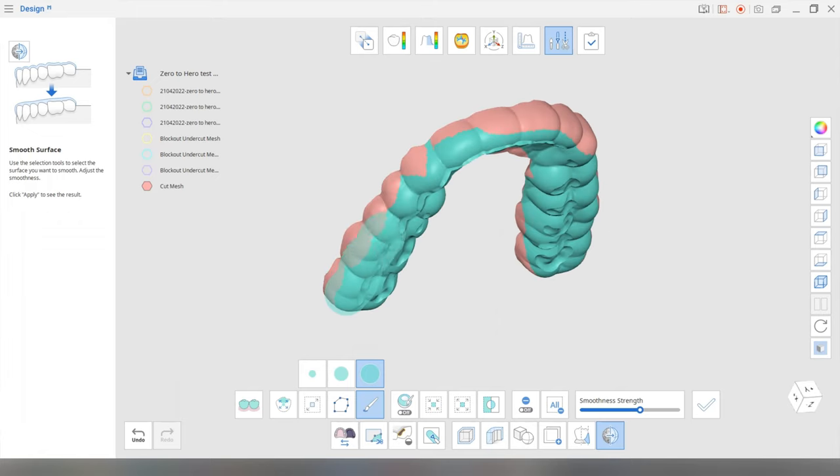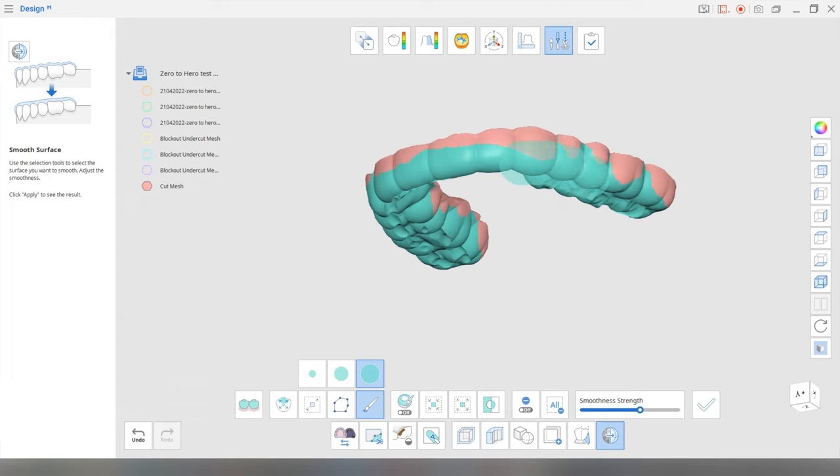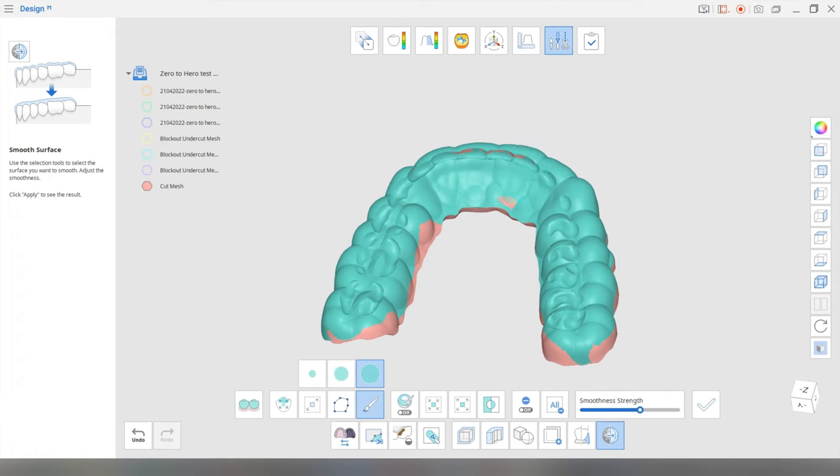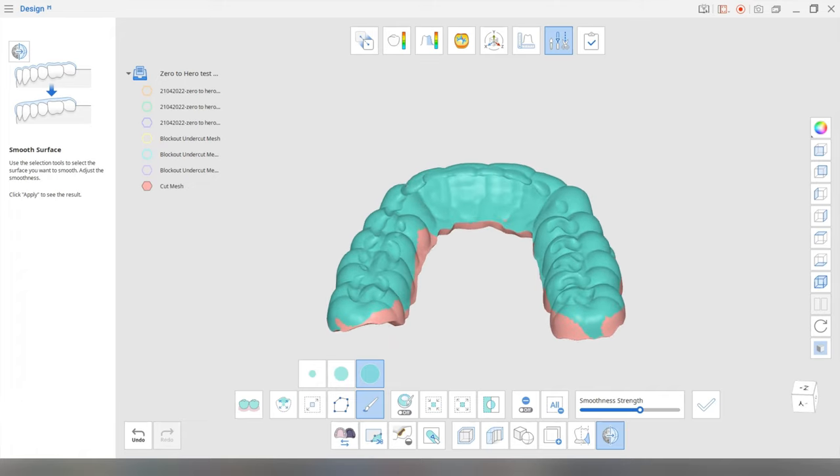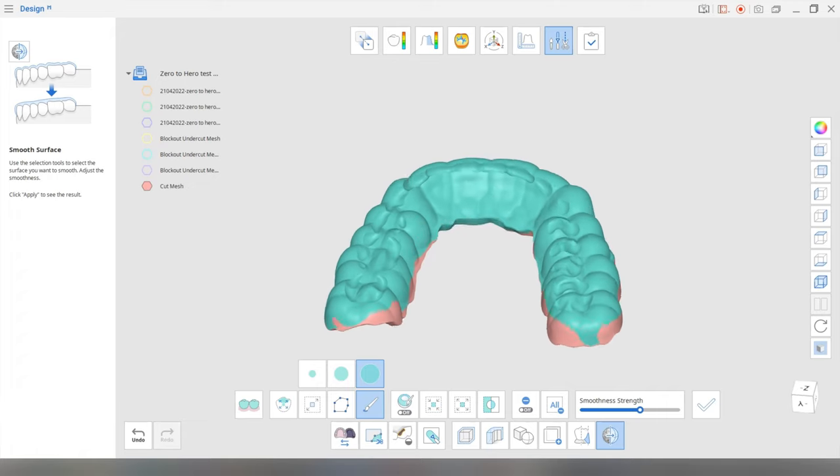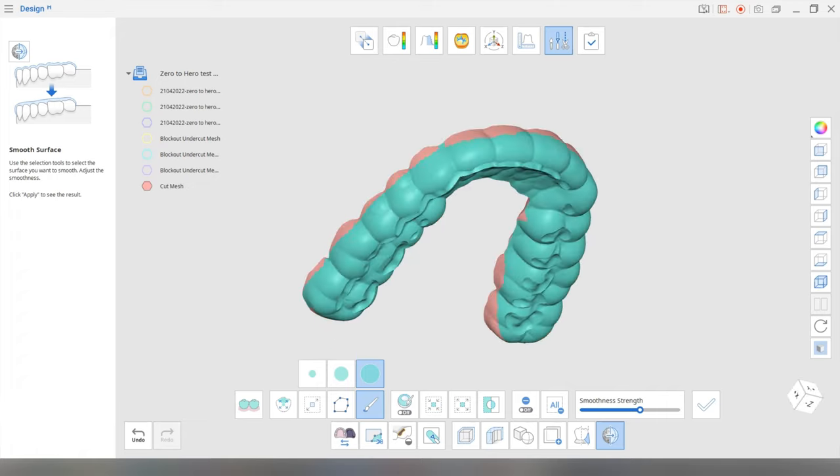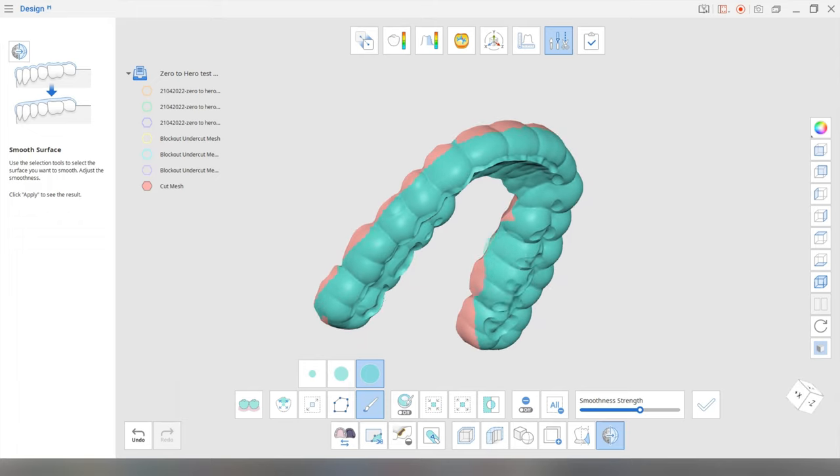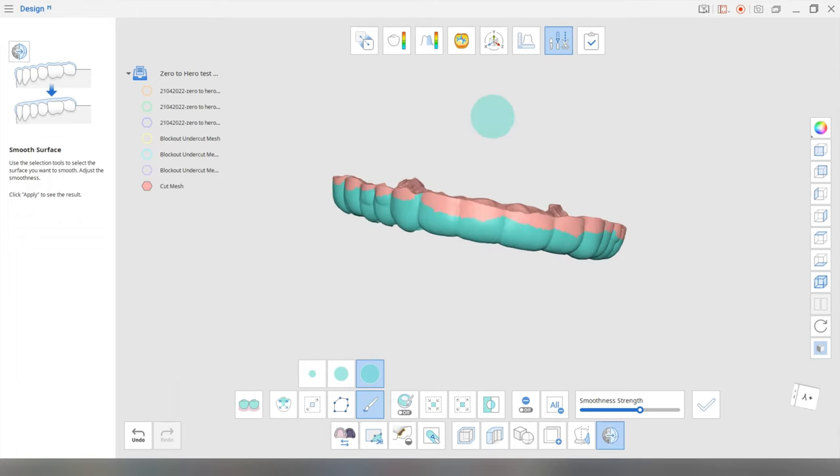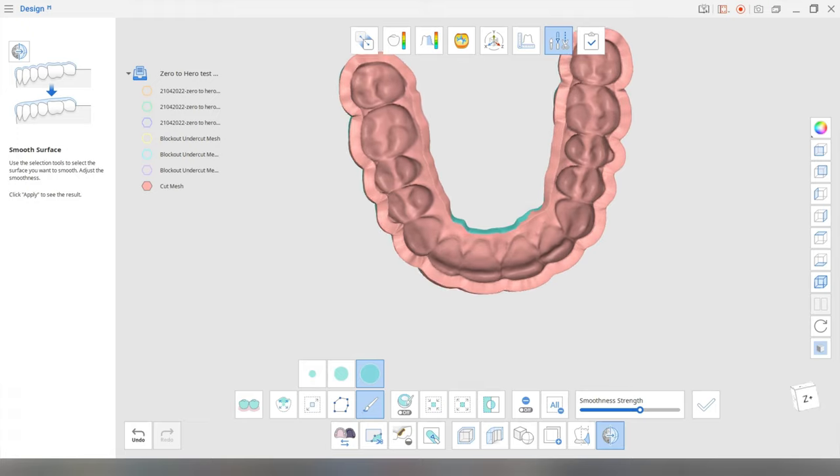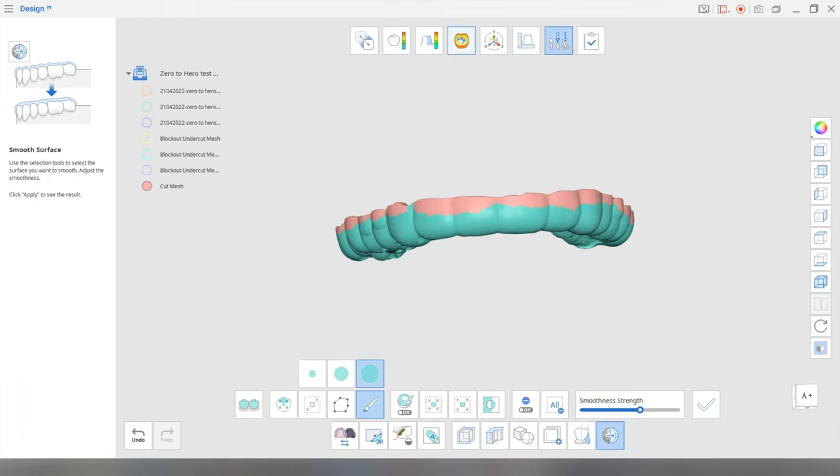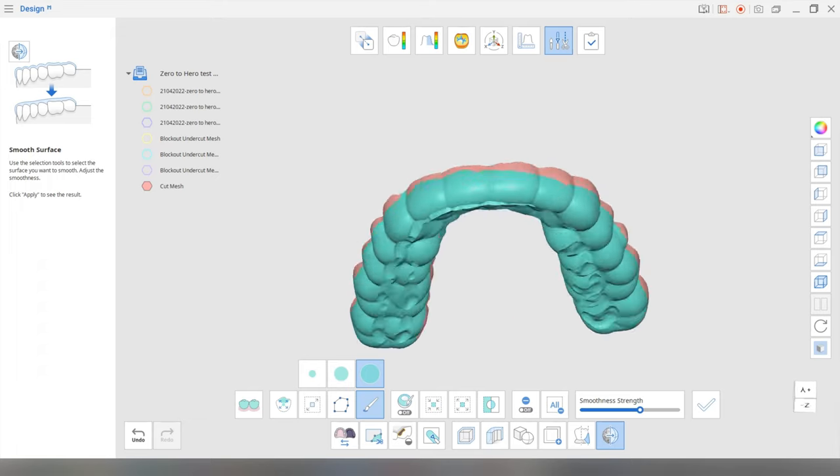So I'm just going to do it over here as long as you do not smooth that precious fitting surface, because then you're going to be in trouble and your splint's not going to fit. And you've got to be careful, especially at the front where it's not being shown over here. You can miss that in your smoothing process. I'm checking that my fitting surface is not painted.